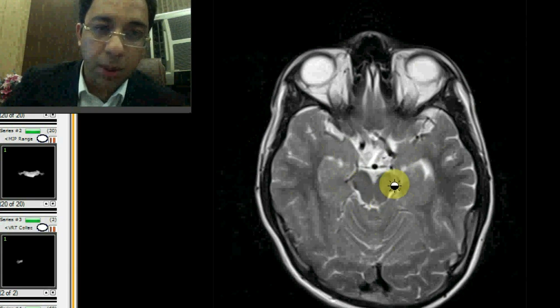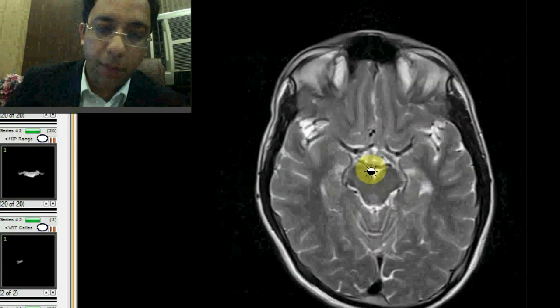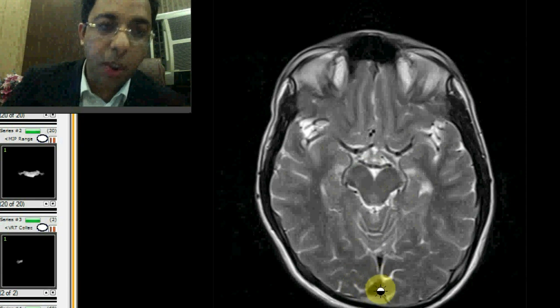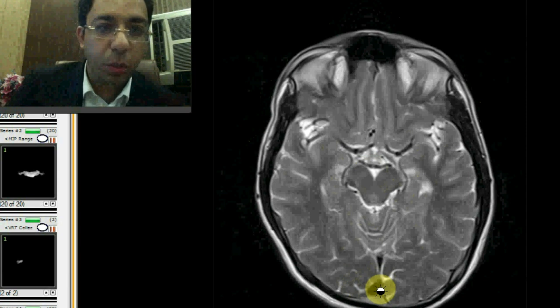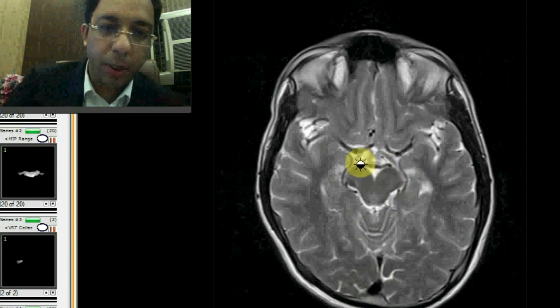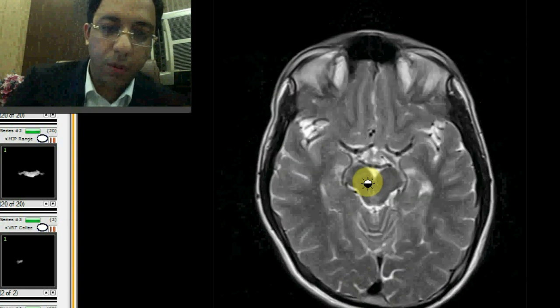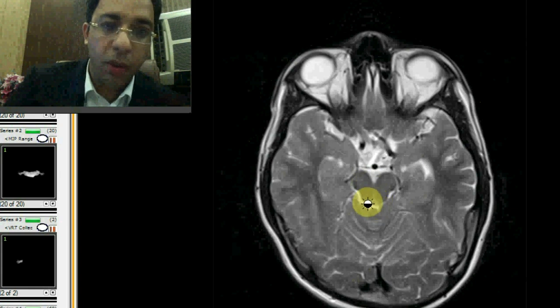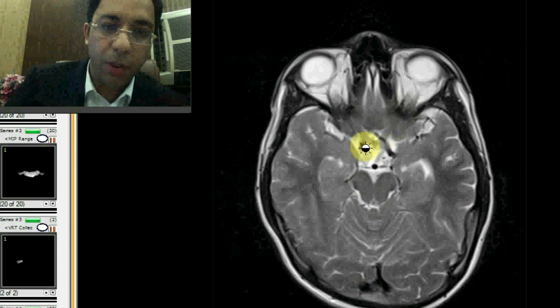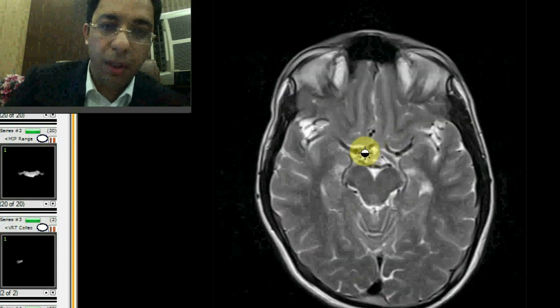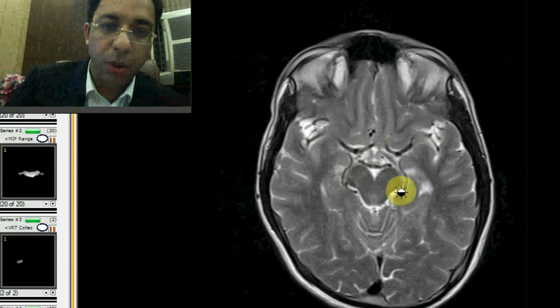This is the area of the ambient cistern and the quadrigeminal plate. Looking at the posterior part, you can see a triangular flow void which is the superior sagittal sinus. This is the area of the substantia nigra and the red nuclei. If you take a careful look, this is the aqueduct of Sylvius. You can see the optic chiasm, optic nerves, the middle cerebral artery flow voids, and the posterior cerebral artery flow void.